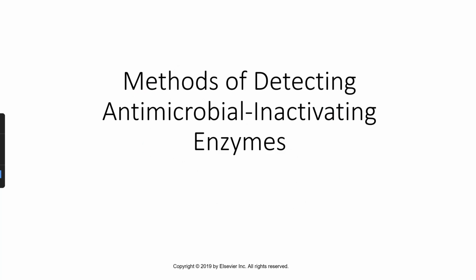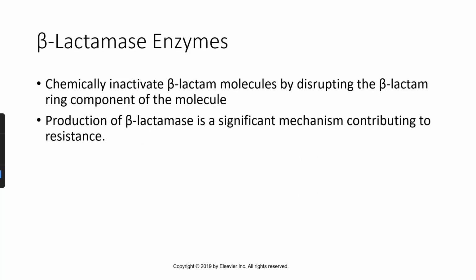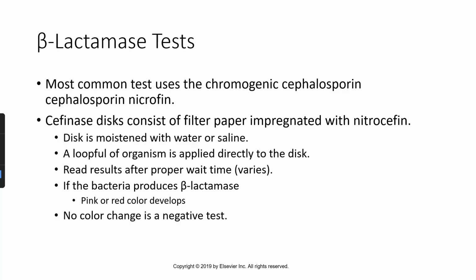Methods of detecting antimicrobial inactivating enzymes. So beta-lactamase enzymes chemically inactivate beta-lactam molecules by disrupting the beta-lactam ring component of the molecule. Production of beta-lactamase is a significant mechanism contributing to resistance. The most common test uses the chromogenic cephalosporin nitrocefin.